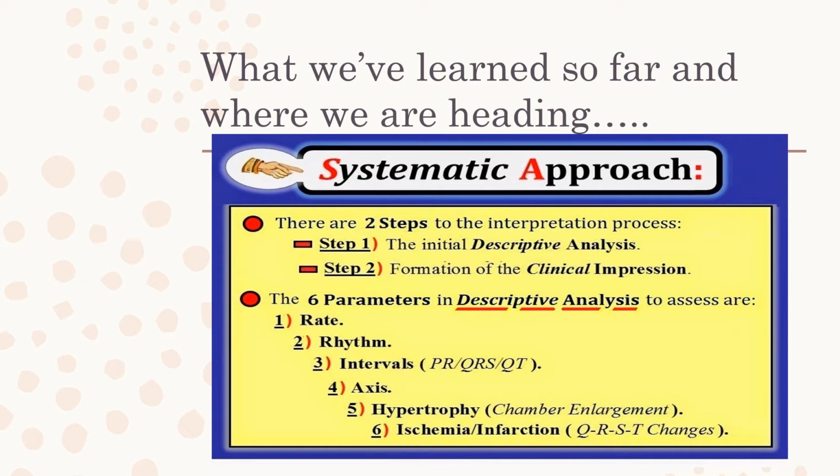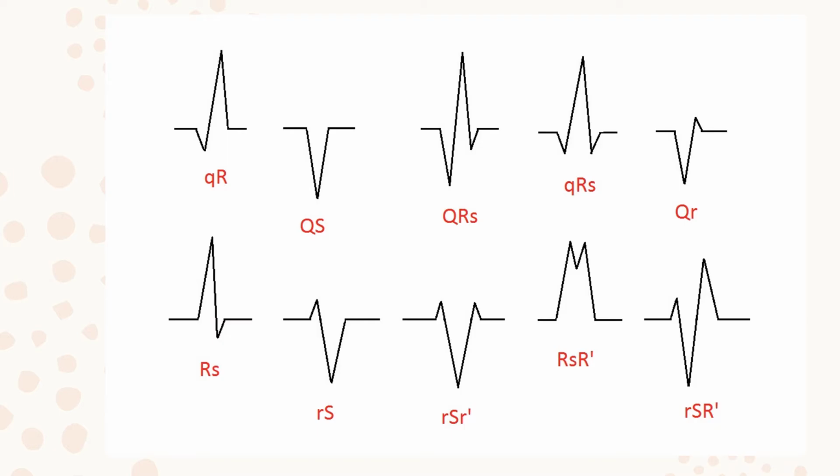Hypertrophy we're going to cover today. And next week you're going to hear from Dr. Dina Bass, and she's going to talk to you about ischemia and infarction. So look how far you've come. By next week, the week after, we're done with school, and you will be able to do all of this. So when we look at a 12-lead EKG, the first thing is to give our descriptive analysis and then formation of a clinical impression. And we do all of this by describing these things, which we've been building on every single day.